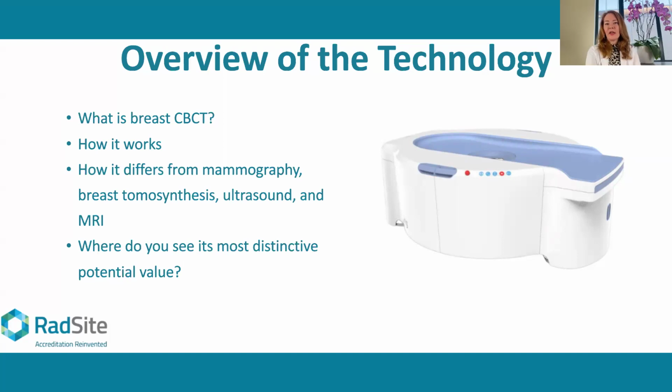Oh, I was going to say the other thing is people have a keen understanding of MRI, and MRI is an example of true 3D imaging of the breast tissue, where when we look at the summation of all of the information that the MRI collects, we can create essentially a model of the breast and spin it around and see all of the intricacies of the fat lobules and the breast glands, and if there are any masses.